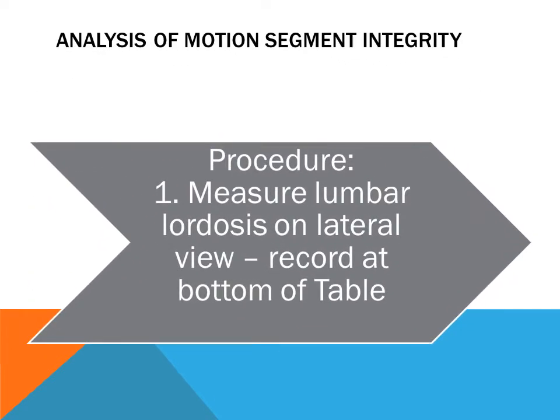Okay, so to begin with an analysis of lumbar spine motion segment integrity, begin with your neutral lateral lumbar projection. And begin by measuring the lumbar lordosis.